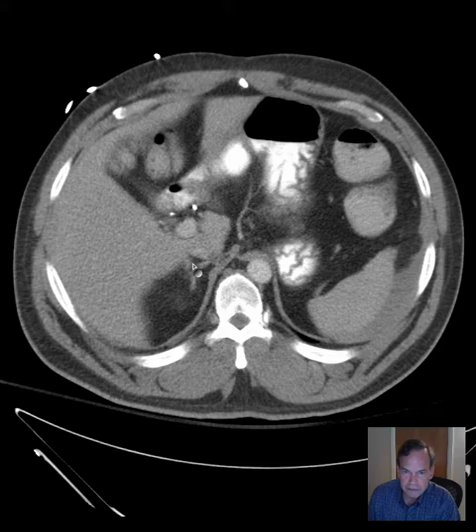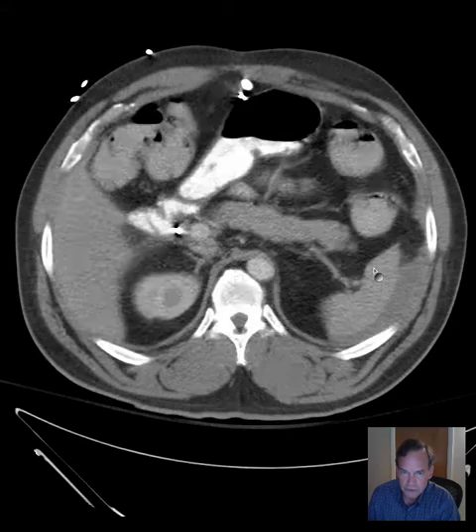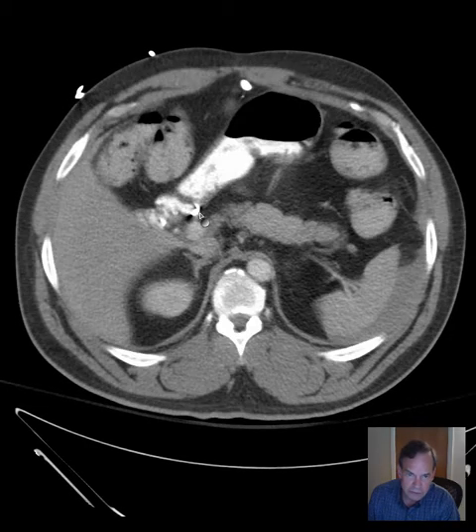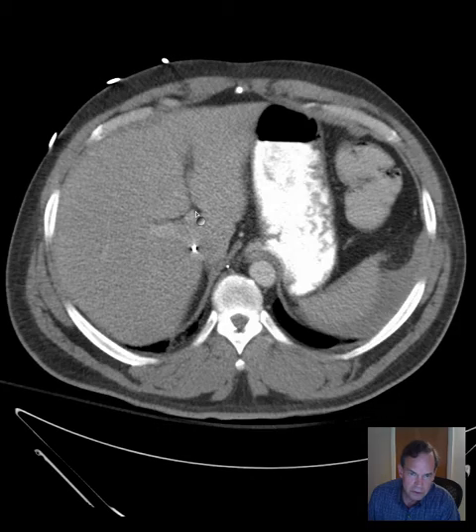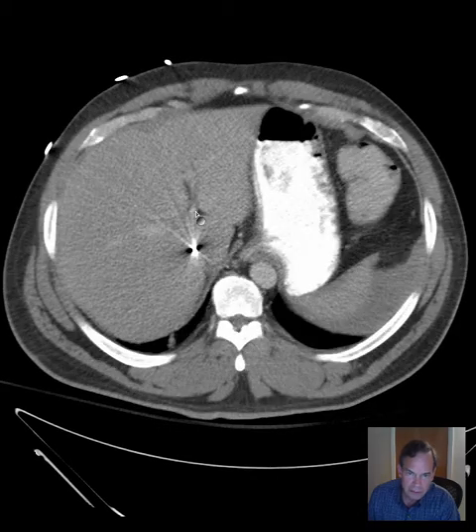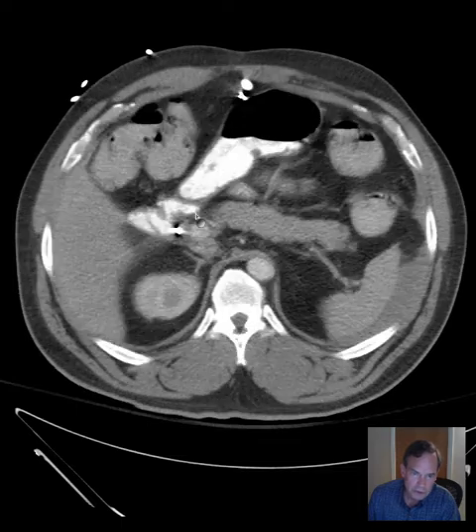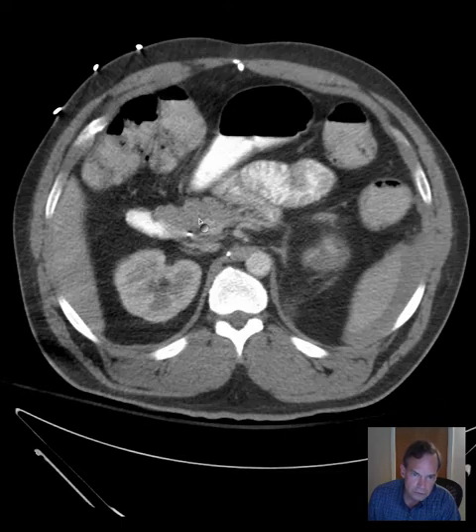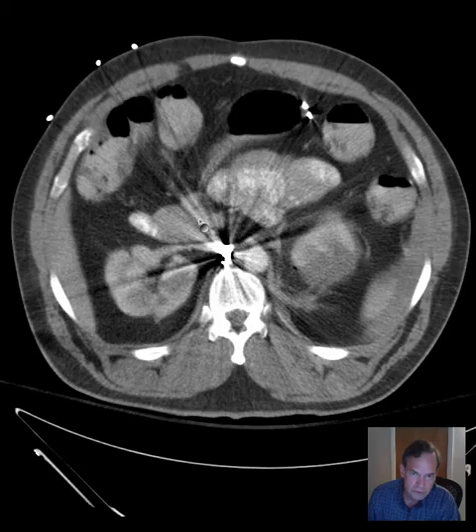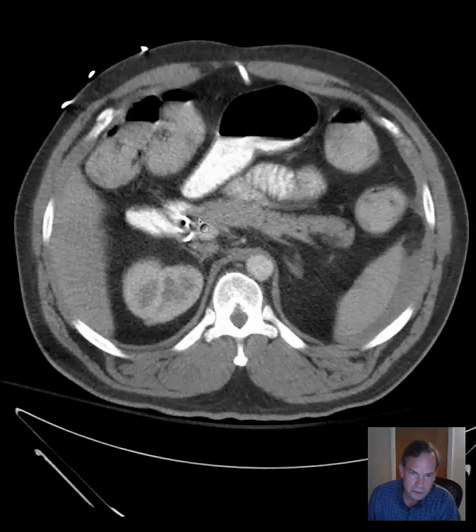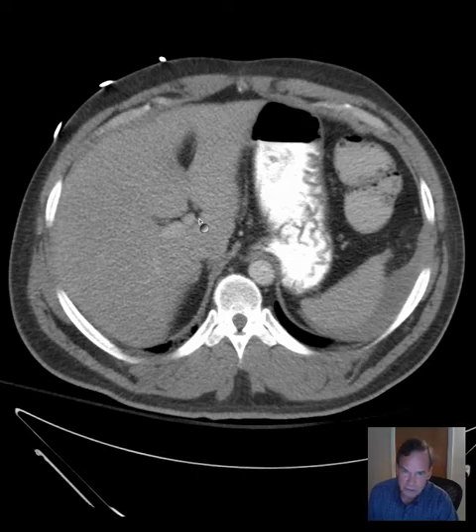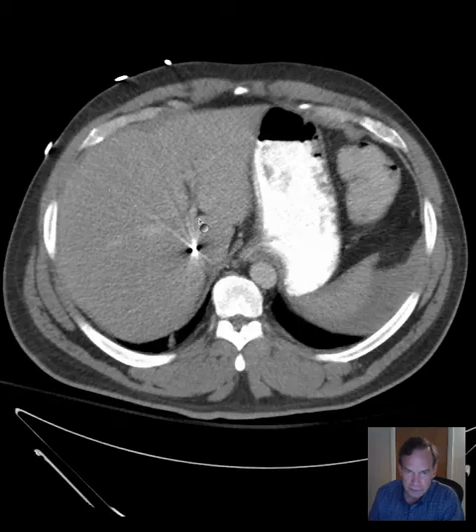So liver, spleen, and pancreas have the abnormalities we've just discussed. The gallbladder has been removed and I see what look like surgical clips, but we have metal of other etiology there too — some of these at least look like surgical clips, but some could also be bullet fragments in this patient who obviously has had a gunshot wound to the abdomen.